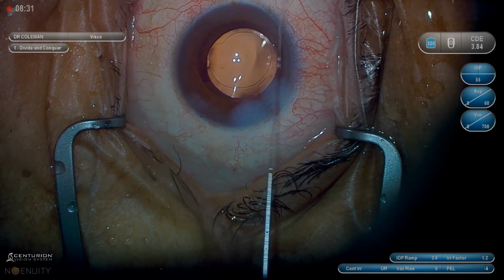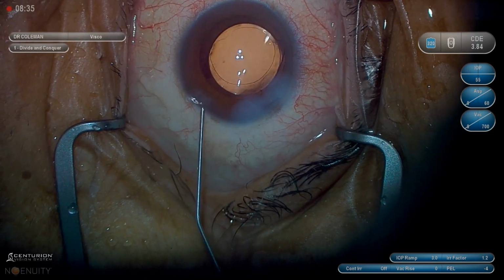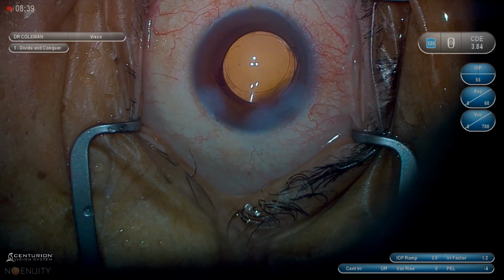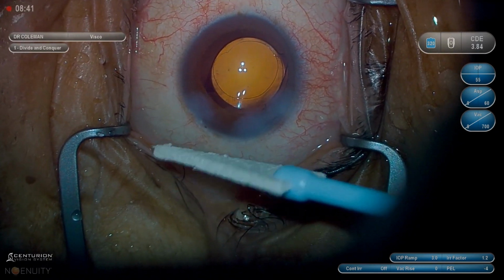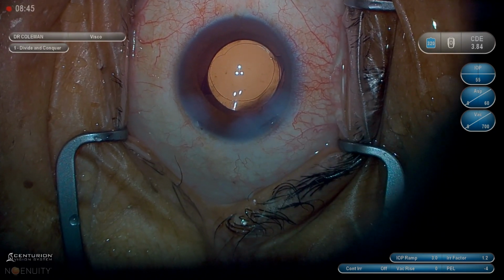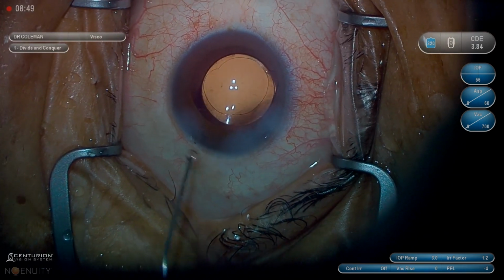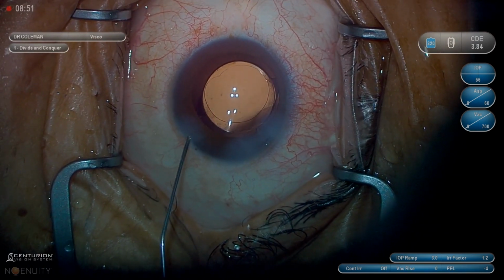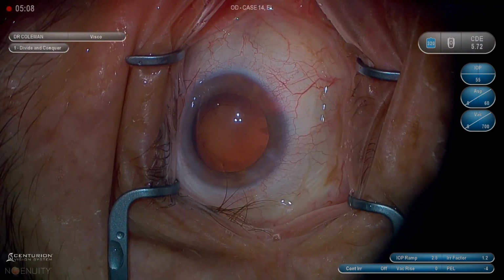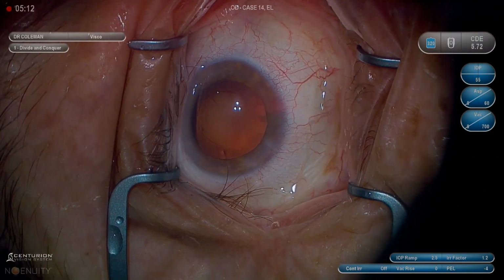Now, if you have a complicated case, if you end up doing a vitrectomy, putting a lens in the sulcus, if you're worried that everything's destabilized, if you use a capsular tension ring, which I'm a big fan of, don't feel pressure to go behind the lens. Leave all the viscoelastic you want, and if they're not a contraindication, give the patient Diamox, give them topical drops, give them Combigan. Don't push a bad situation trying to get every little bit of viscoelastic out of the eye. If you use Diamox, their pressure will come down.